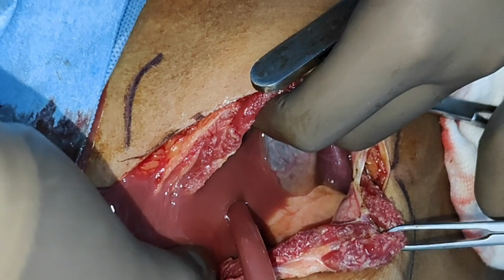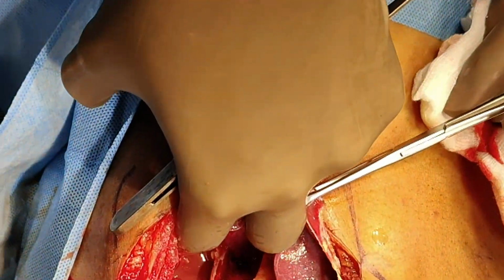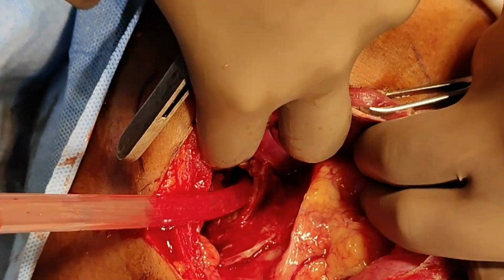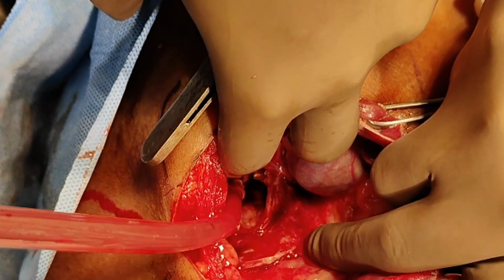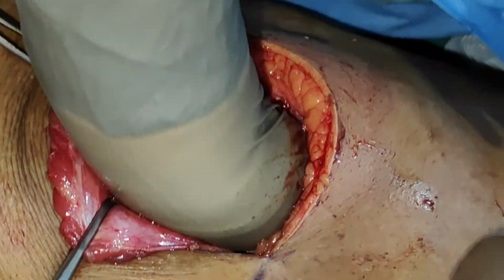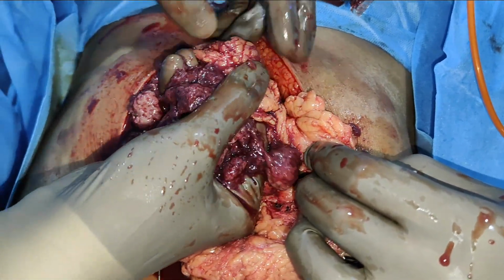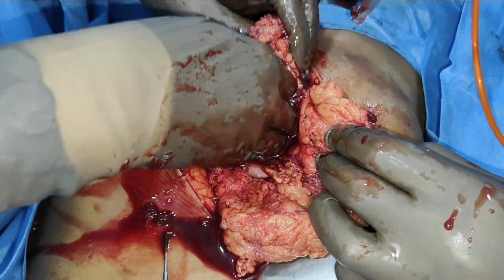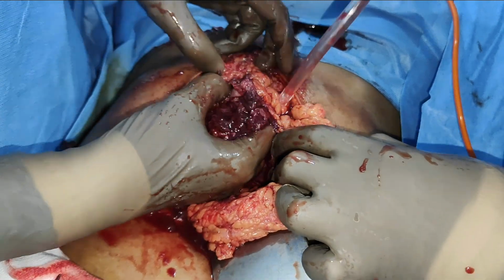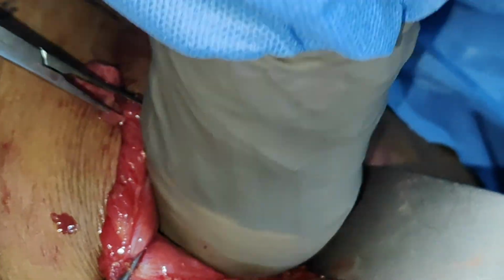Once this pus was completely aspirated, we decided to go for the widest possible deroofing of this cyst. We treated it as a symptomatic liver cyst in which the widest deroofing possible is done. Now, in view of infection here, we had to debride the cyst cavity completely. The contents which were there, infected muck and the infected solid component of this cyst, were completely removed with hand. There was no hydatid membrane or no evidence of a hydatid cyst in this. The complete solid muck was removed and the cyst cavity was completely cleaned.